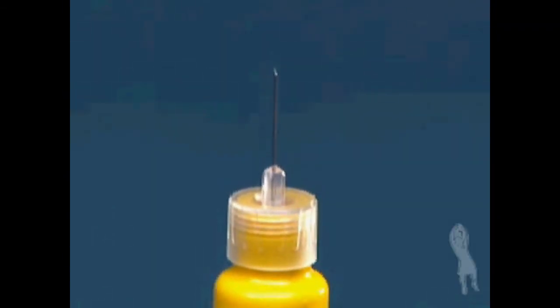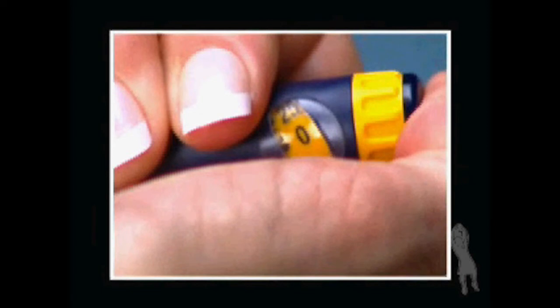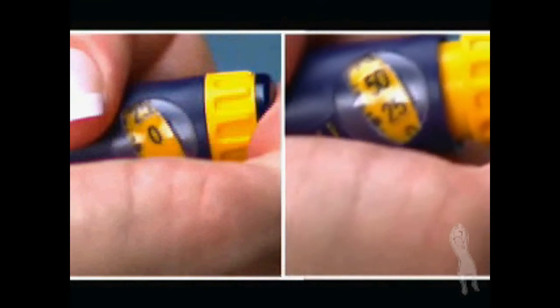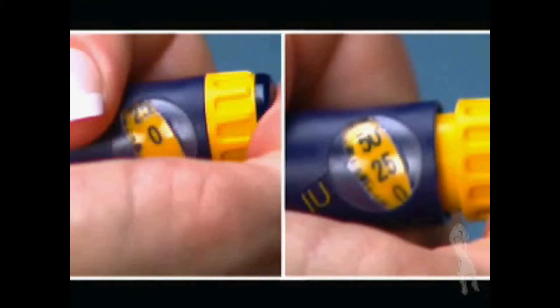Use the BD Microfine pen needle for one injection only. Look at the dosage window. The middle of the dosage window should display a dot next to the zero. If the injection button does not push all the way in and the number in the dosage window does not read zero, it means there was not enough medication in the cartridge to complete your dialed dose.